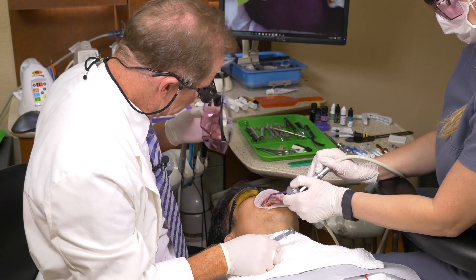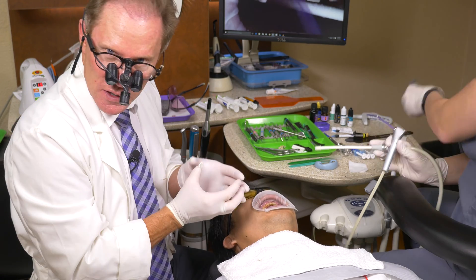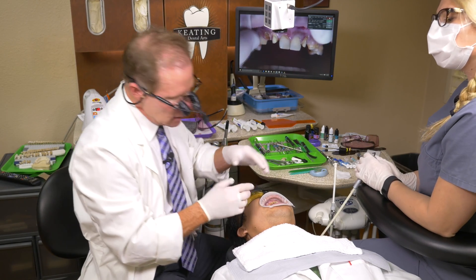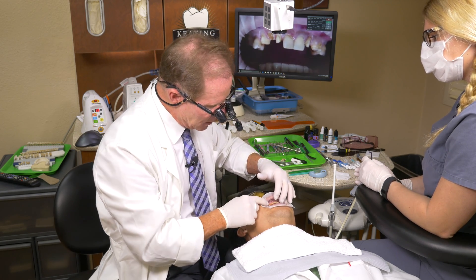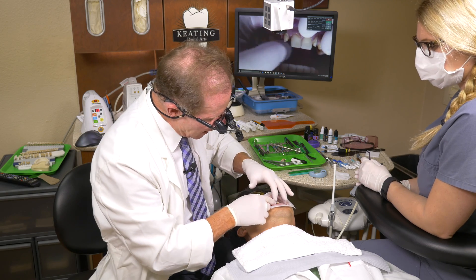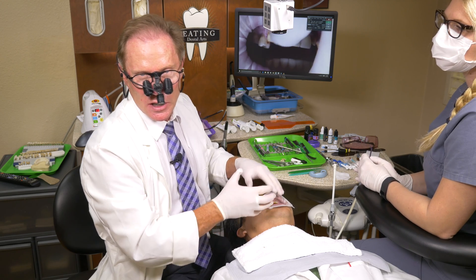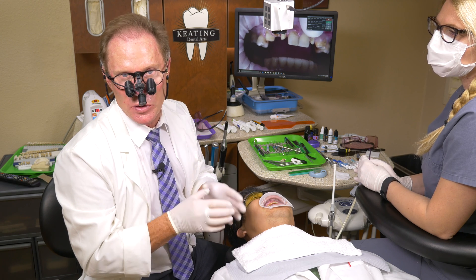Go ahead and rinse, dry — and there's our ovate pontic site. Our provisional will fit down to that site to maintain it. There'll be no postoperative pain with that at all. The diameter is such that it corresponds to the root form of this particular canine. We want to make sure the facial portion is up where we want the height of the tissue. The ceramics — we're going to do an all-ceramic bridge here — will create a pontic that exits that tissue just like a natural tooth. We'll come back when we're done and show you what that ovate pontic looks like, and what it looks like in the mouth. Next time you place a bridge, especially in the anterior, start thinking about designing the ovate pontic and the tissue so that it looks like a natural tooth and it's cleansable — that's where the ovate pontic comes into play.